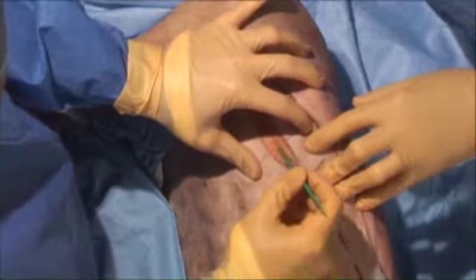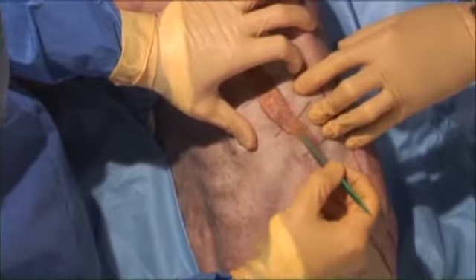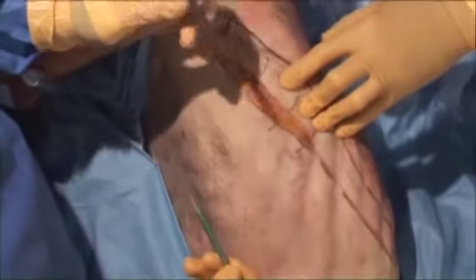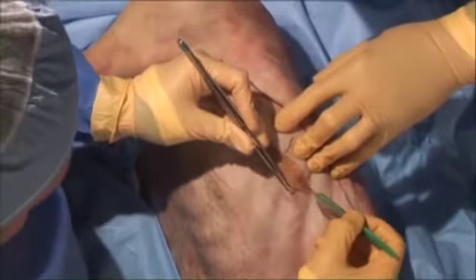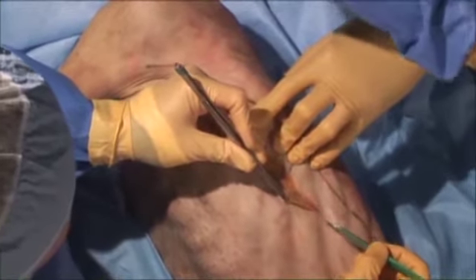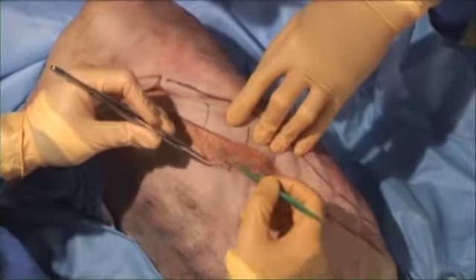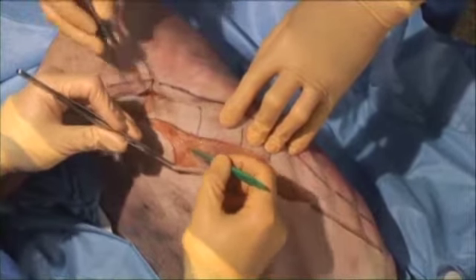Fair pickups. Yeah. So through the skin and down to the serratus. And I'll work the flap anteriorly to preserve the serratus.